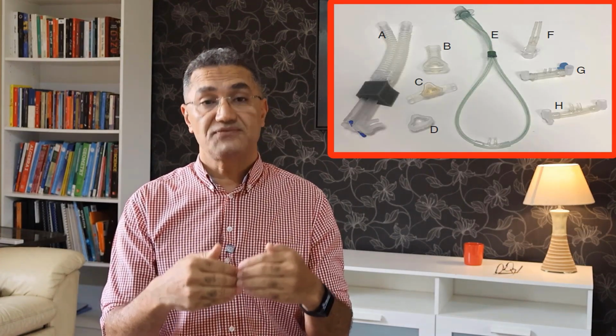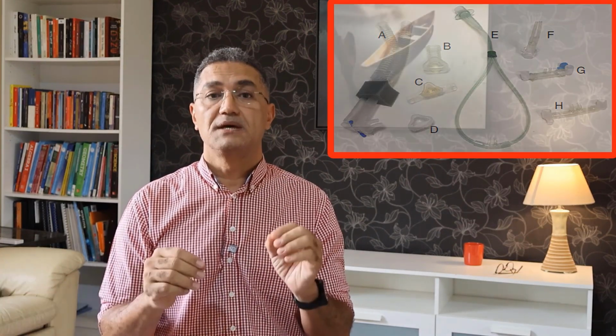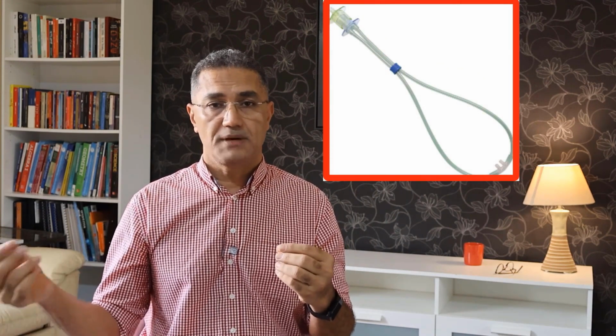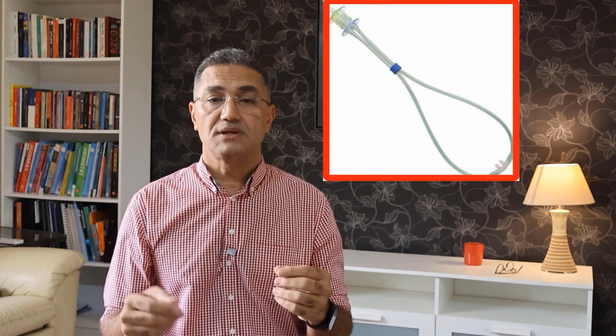Now this brings us to an important question. What's the story with the RAM cannula that we hear about so much? In the NICU or in pediatrics, you'll find something called the RAM cannula. They say, give him CPAP with the RAM cannula, or give him BiPAP with the RAM cannula. What's the story with this RAM cannula?